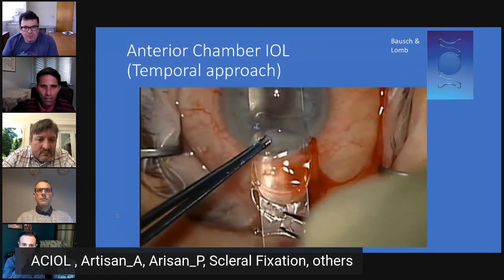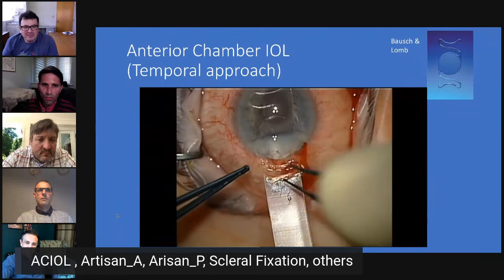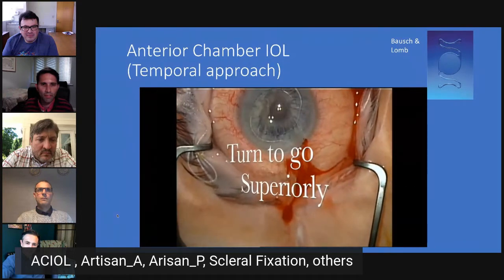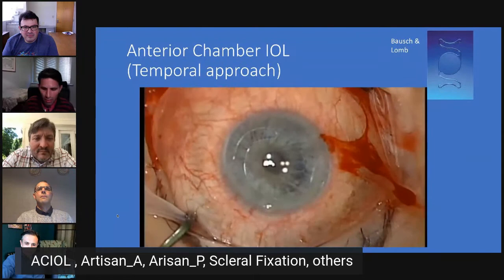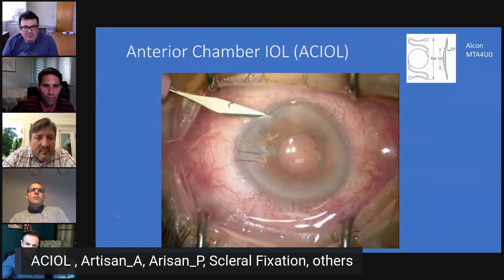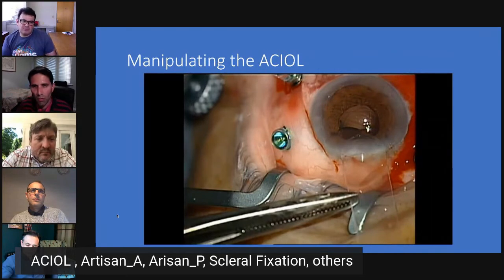Zorro is good. And then you, as Ahmed so nicely and more elegantly than I am demonstrating, put the IOL into the AC. And then in this particular circumstance, I then went superiorly to do the peripheral iridotomy. You can go from the front, from the top, I'm not going to show that. But if you go from superiorly, I do like to manipulate the eye. We do measure it white to white horizontally. So I like to put the IOL in horizontally.